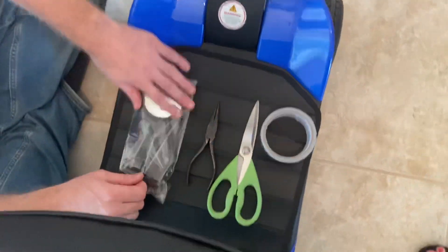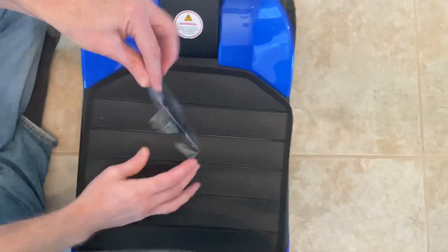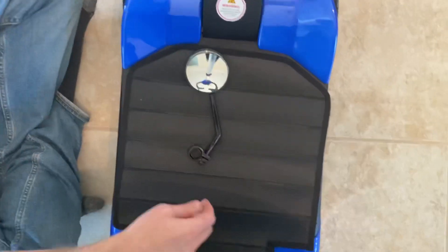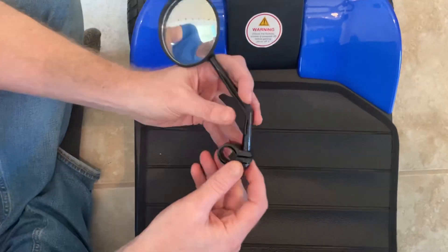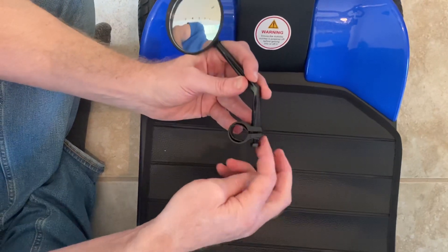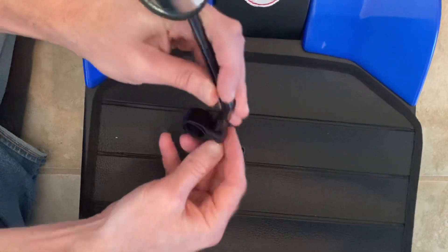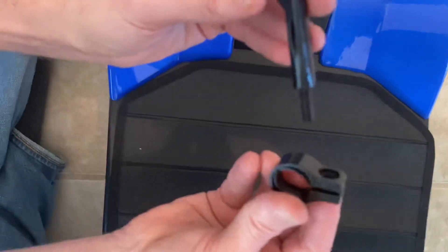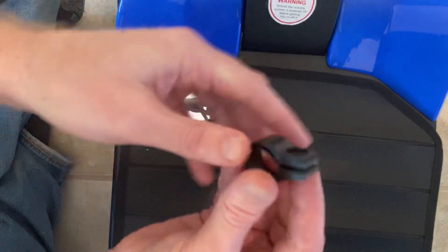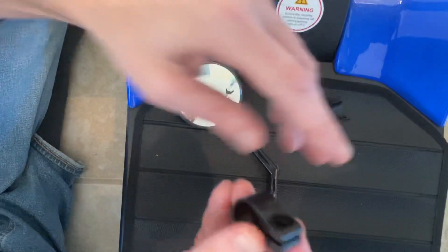Let's take a look at the actual mirror kit that comes with this scooter. We'll clear our workspace and take this out of the bag. You can see that these mirrors are fully adjustable. Basically I have a little bolt, a little washer, the actual attachment, and then a little rubber piece so it doesn't rub on the bar.